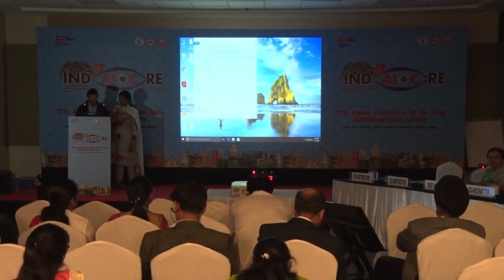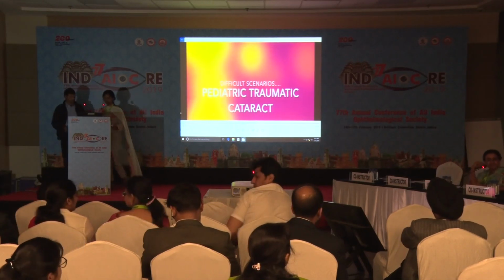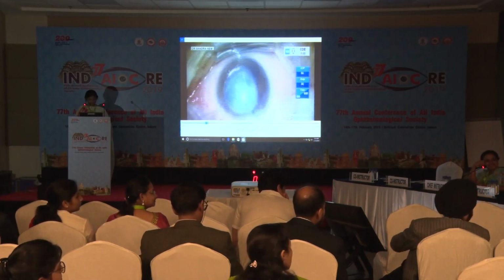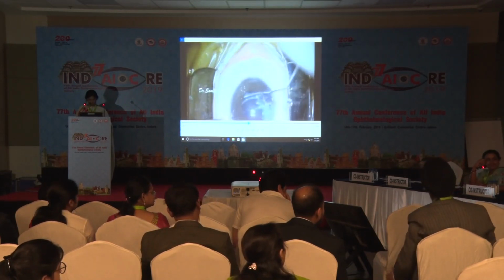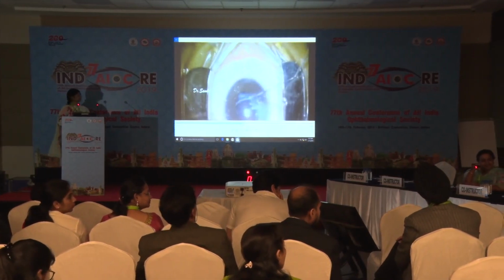How many here in the audience do pediatric cataracts? What is the youngest age you prefer to put an IOL implantation? 2 years, sir, if it's a unilateral cataract. More than 1 year. Anybody has a different opinion? IOL implantation, sir. And your follow-up of?